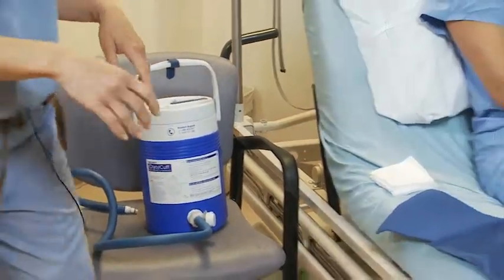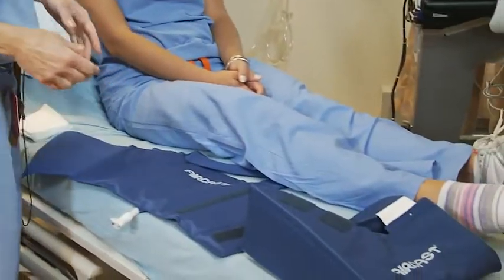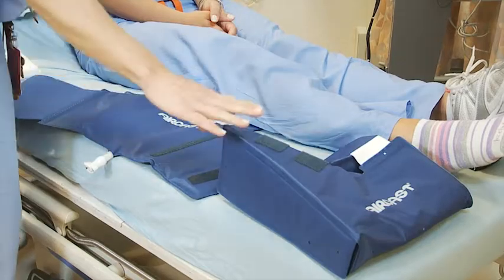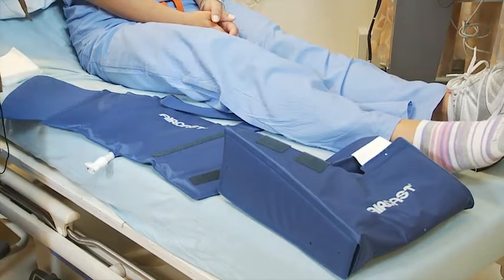The next thing you're going to do is connect. We have two different systems we use for the CryoCuff. One is an ankle and one is a foot. Whatever one, they both are the same scenario. We'll do the foot one first.